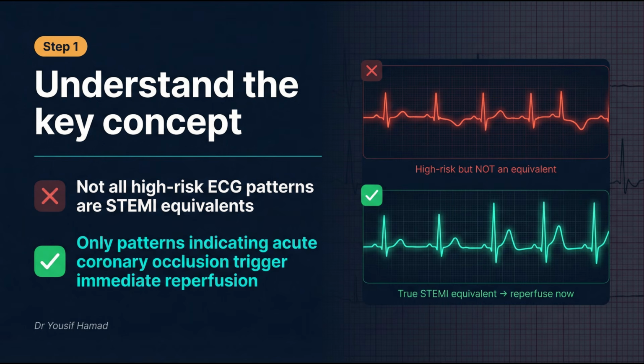Step 1. Understand the key concept. Not all abnormal or high-risk ECG patterns are STEMI equivalents. Modern guidelines emphasize that only specific patterns indicating acute coronary occlusion should trigger immediate reperfusion pathways.